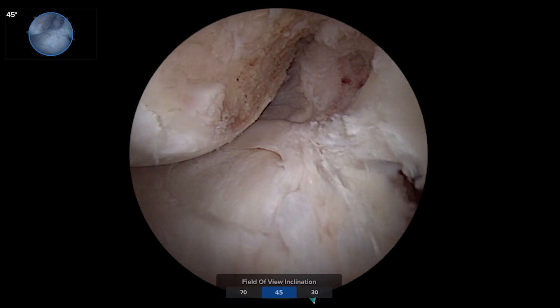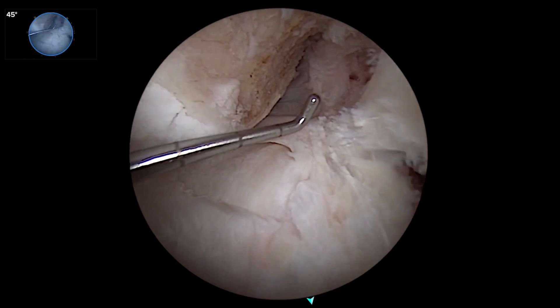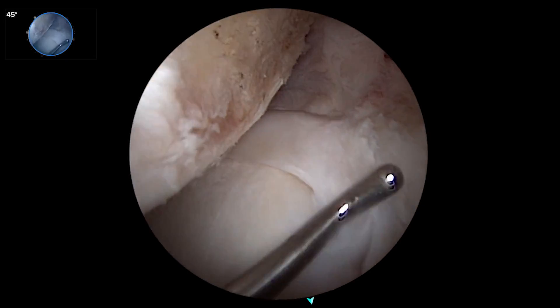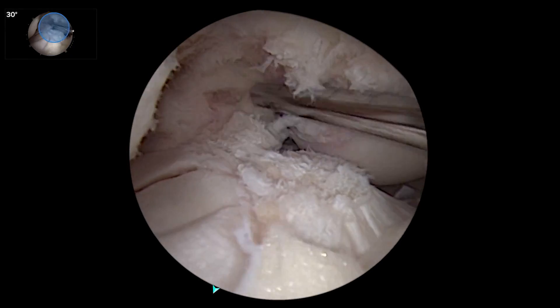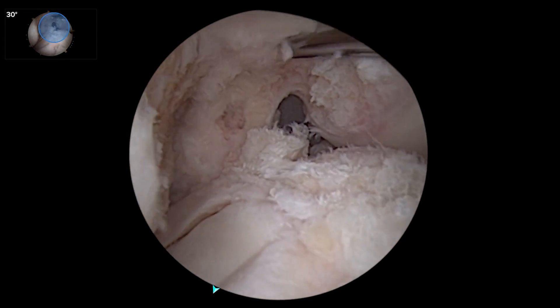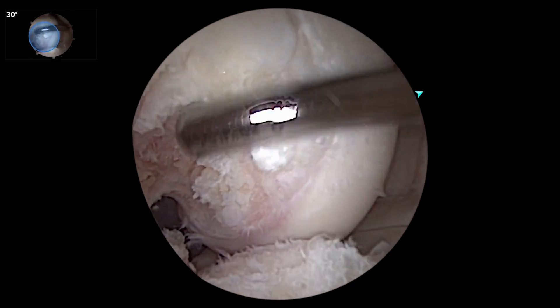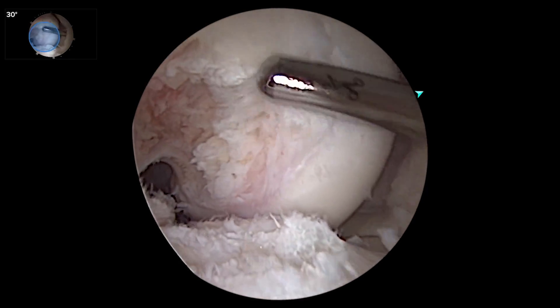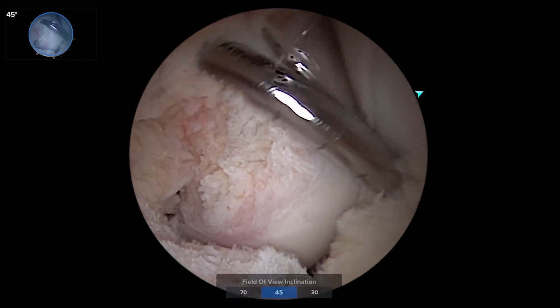Both going from 70 and even at 30, but the panoramic view for sure, you can see that this area for repair isn't here — it's way up here. So we're taking out a PCL like we would in a multi-ligament knee doing a bicruciate reconstruction. Viewing from the anterolateral portal straight over — this is the 30-degree view — and if I go to the wide-angle view, it just brings the whole condyle into focus.